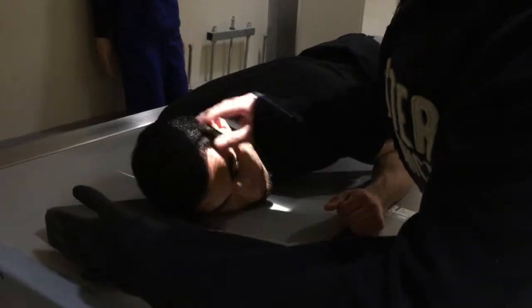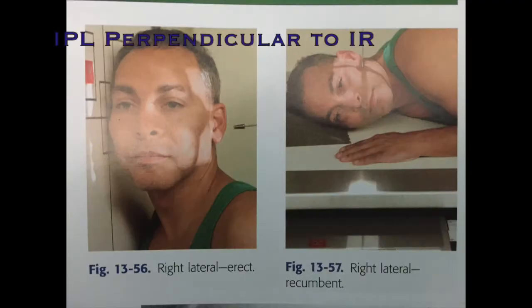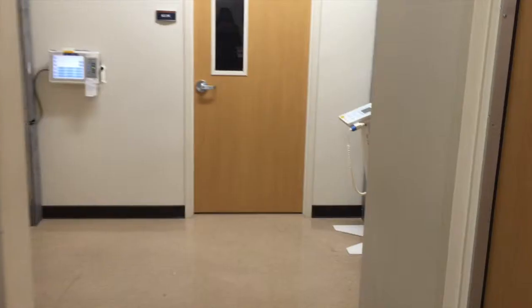Make sure the head is in a true lateral position and oblique the body as needed for the patient's comfort. Align the mid-sagittal plane parallel to the IR and the interpupillary line perpendicular to the IR. Center the CR to the zygoma, which is the prominence of the cheek, or midway between the outer canthus and EAM.